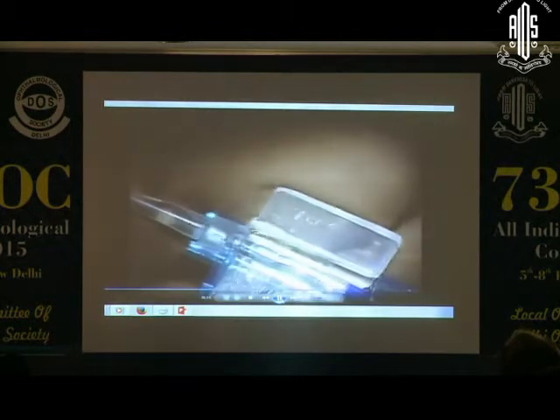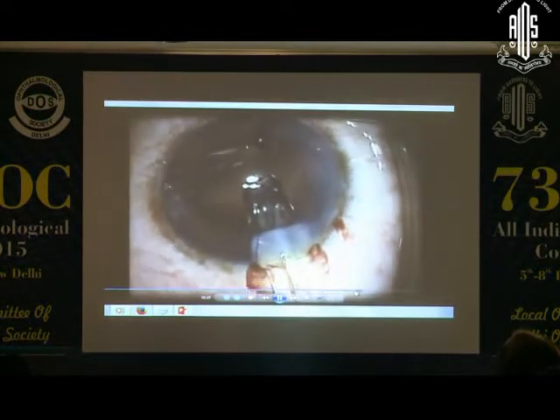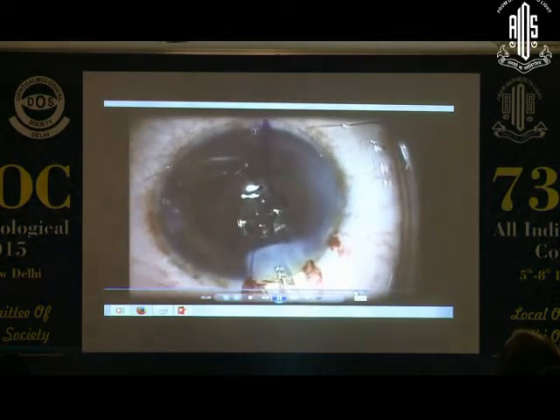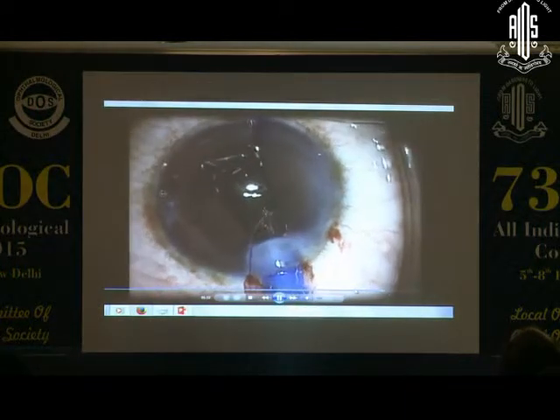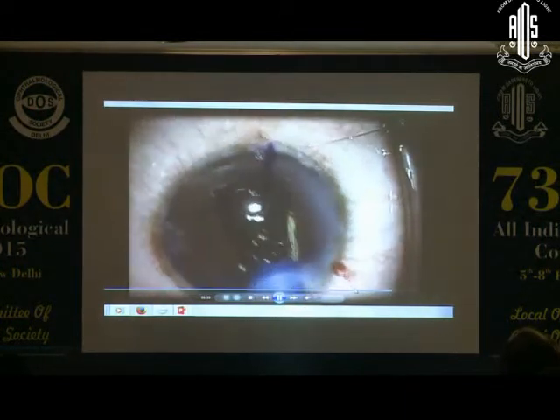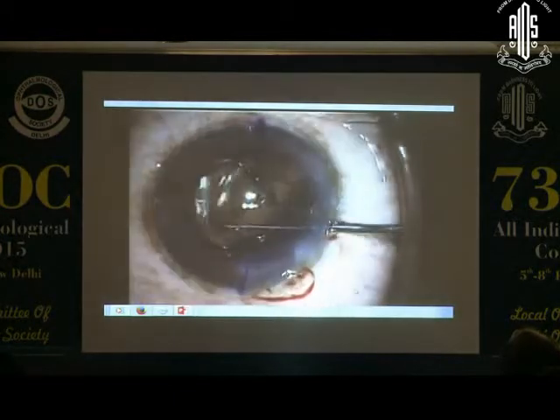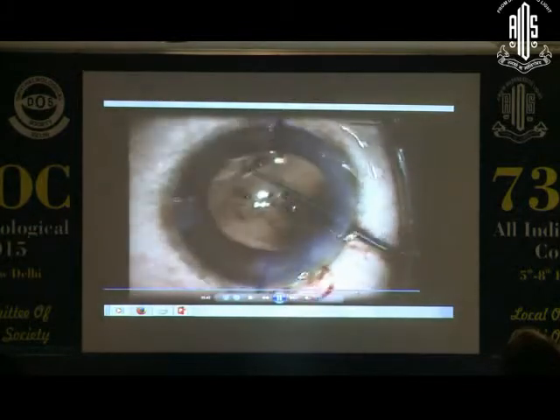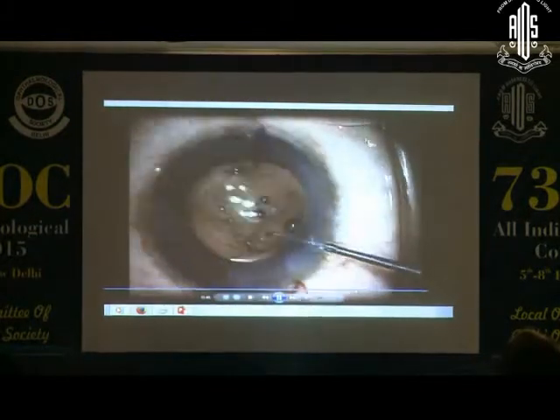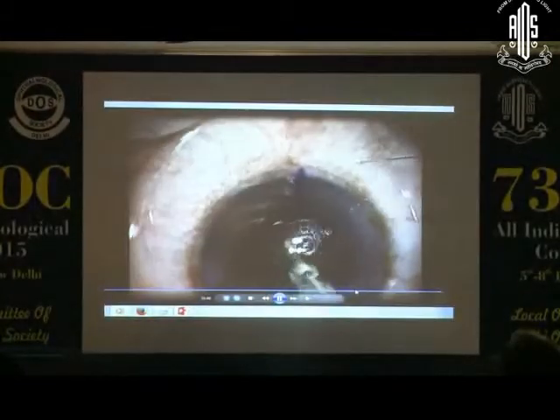This lens, the upper lens, is a preloaded lens, which can go through a 2.4 comfortably. Goes in. This is under cohesive viscoelastic. Turn, you can see the marking there. And the marking is about 10 degrees short. You can stop. And then take the viscoelastic out, particularly from behind the lens.